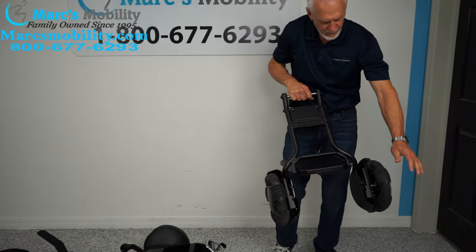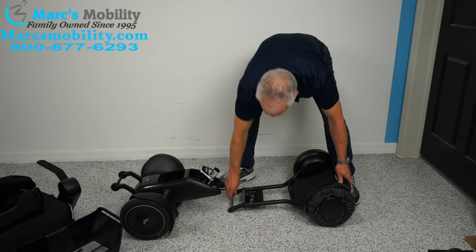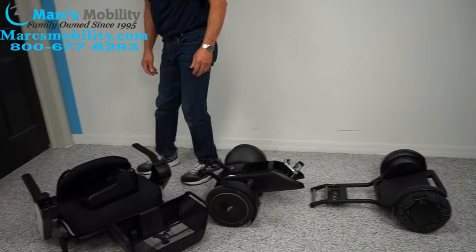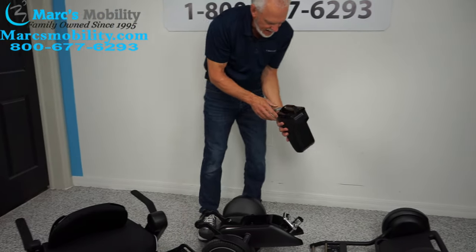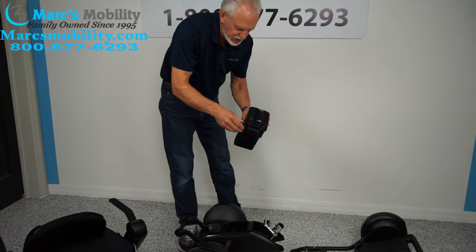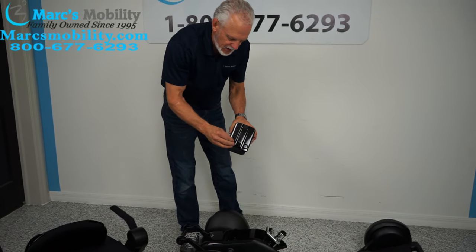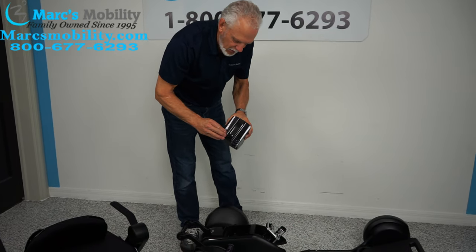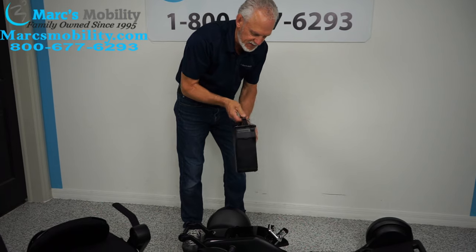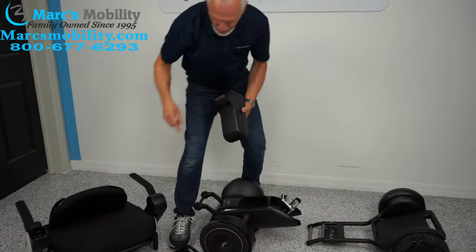You have your front end, your base, your seat, and your battery pack right here. This battery pack is a lithium ion battery — you can take it in the house and charge it right there. It weighs six pounds total.